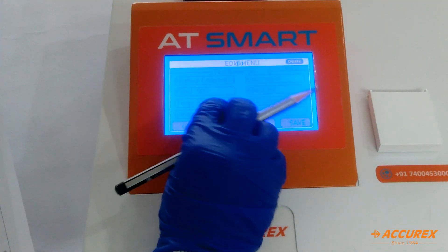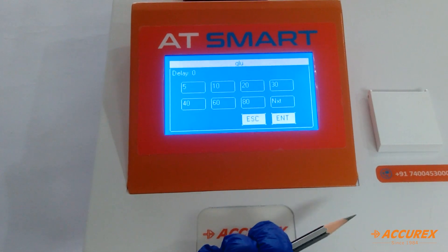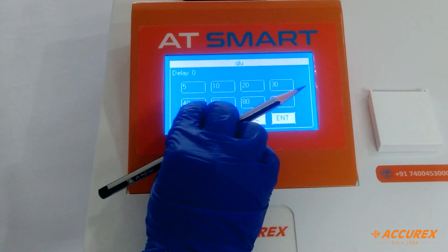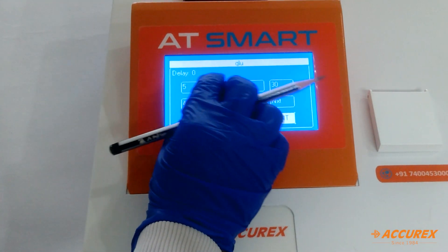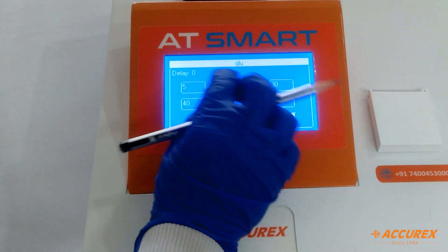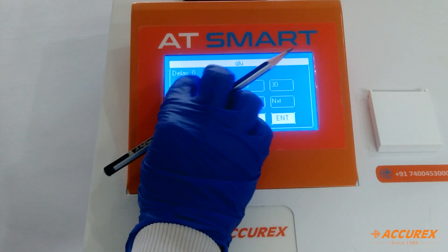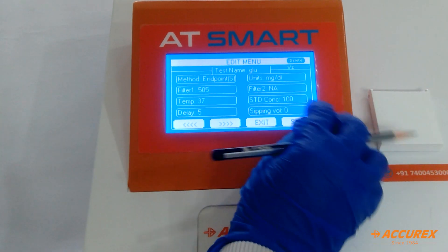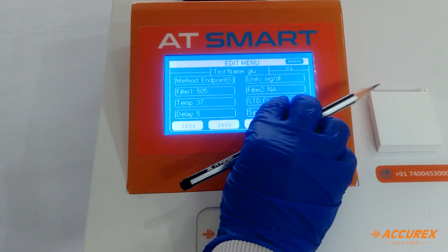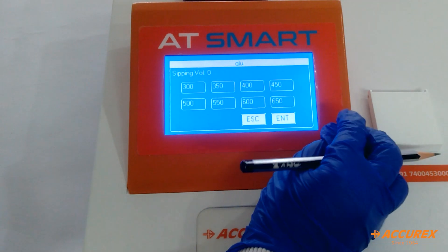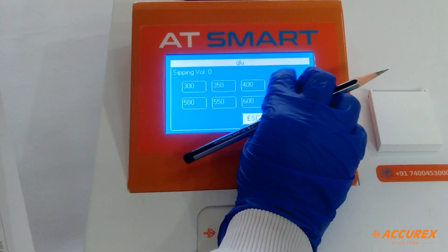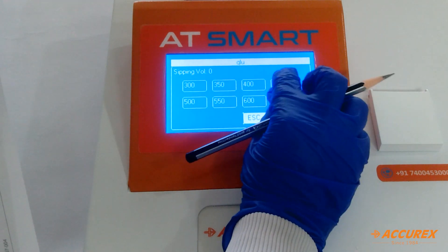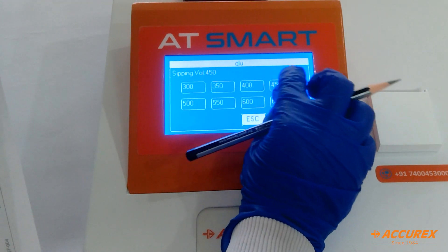Now delay — because it is endpoint chemistry, you can press save 5 seconds and enter. Sipping volume is 450 — press 450 and enter.